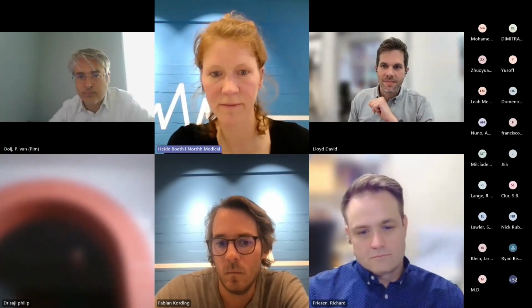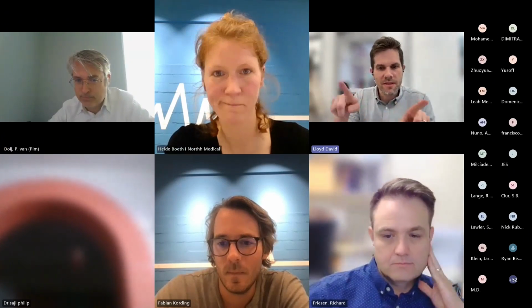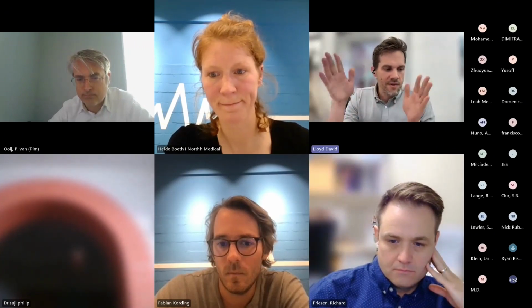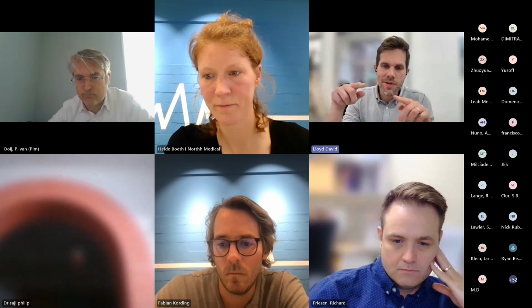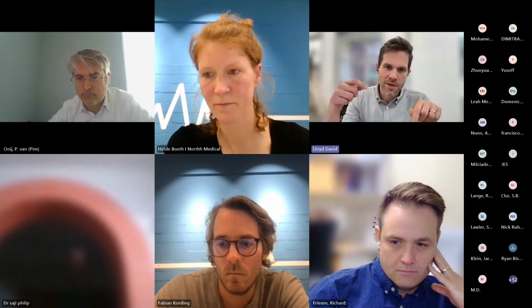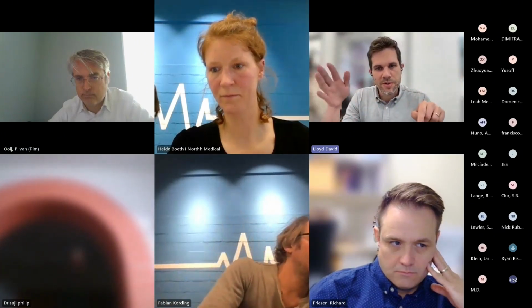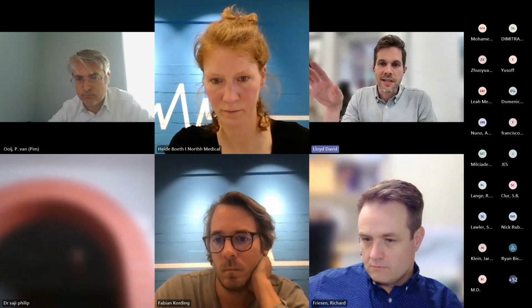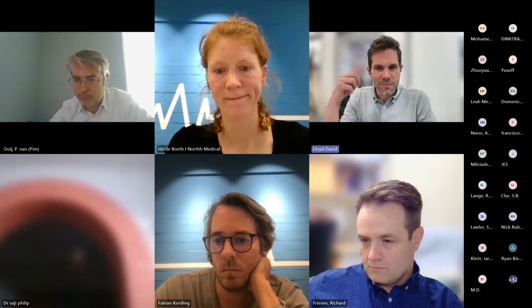All right, then David Lloyd. David, hi. Hi, yeah, great talk, Kim. Really nice. I wanted to make a very small comment about the output resolution. You can essentially improve on the through plane resolution, but there's minimal gains on the in plane resolution. So we acquire at 1.25 by 1.25 by 2.5. When you put everything together, you can get an isotropic volume of 1.25, possibly a little bit above that. If you're going to 0.8, 0.7, you're probably just interpolating. And we had a look at this clinically as well. It probably looks better, and it's actually probably nicer on the eye.